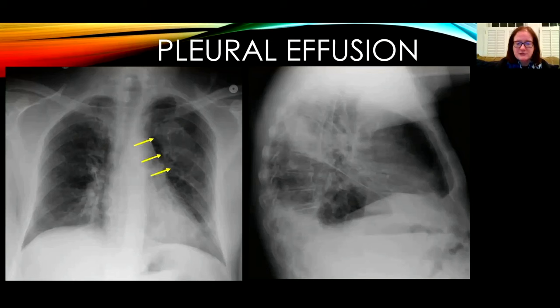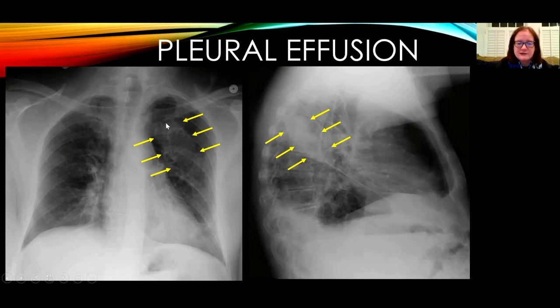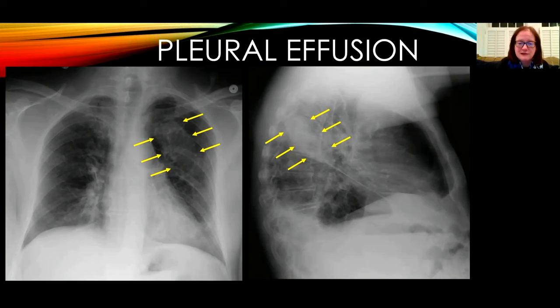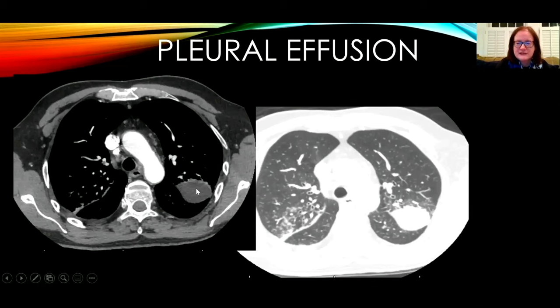This patient has a pleural effusion localized in the upper aspect of the left major fissure. We can distinguish it from a mass by its density — it's not very dense — and there's an overlay sign where lung vessels course through it. It's sharply marginated, consistent with fluid in the fissure, and has a long axis and short axis unlike a lung parenchymal mass. This is the so-called pseudotumor, sometimes referred to as the cigar sign because of its shape. CT confirms fluid attenuation aligned along the left major fissure, and centrilobular nodules due to endobronchial spread of infection are also noted.